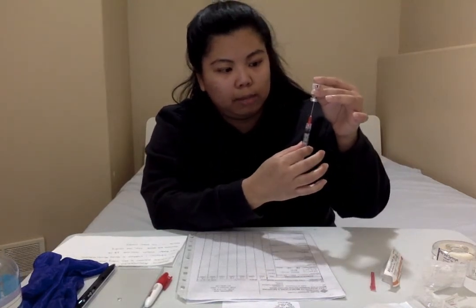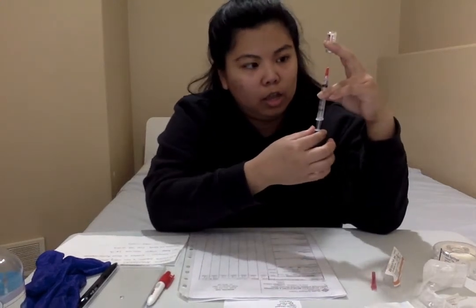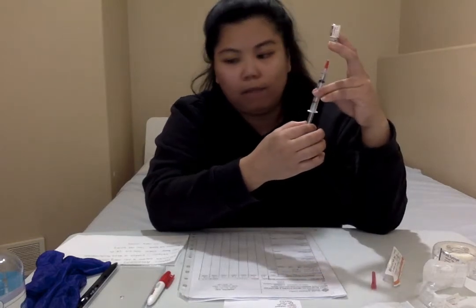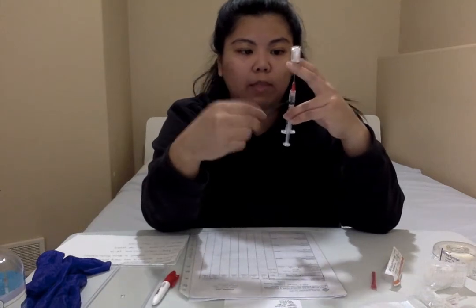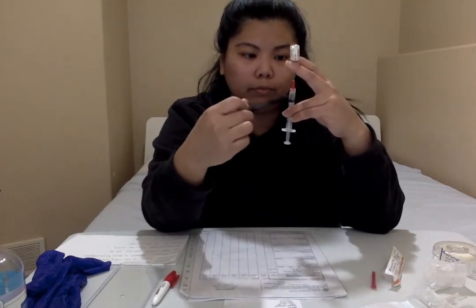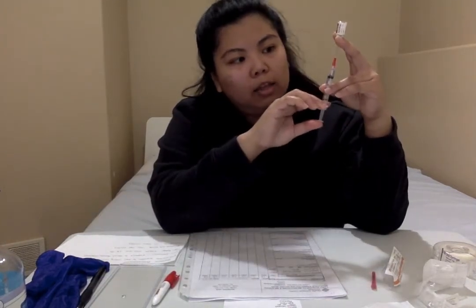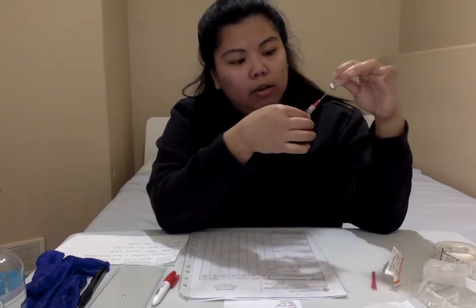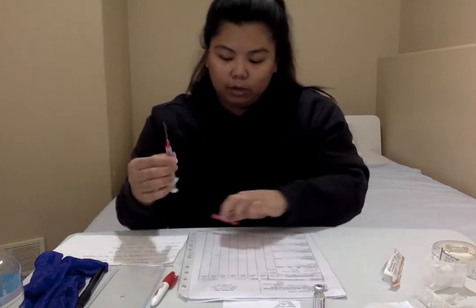So I'm just letting that medication go into the barrel of my syringe, and then I'm just going to pull it a little over the 0.5 ml that we need, just because there's air bubbles, and we want to get rid of that by tapping. Okay, so then I would inject the excess amount of medication back into the vial, and then we'll remove this, and then recap our blunt fill needle.